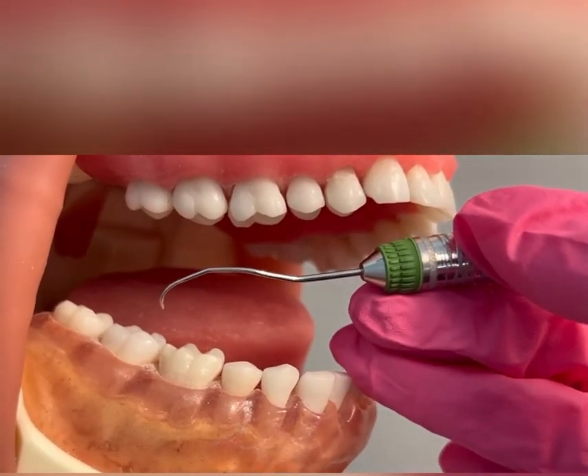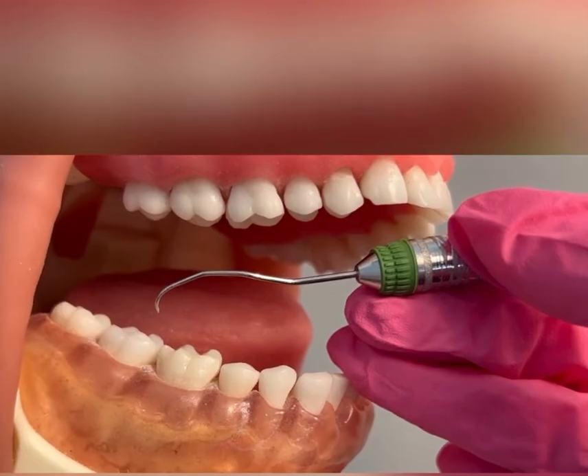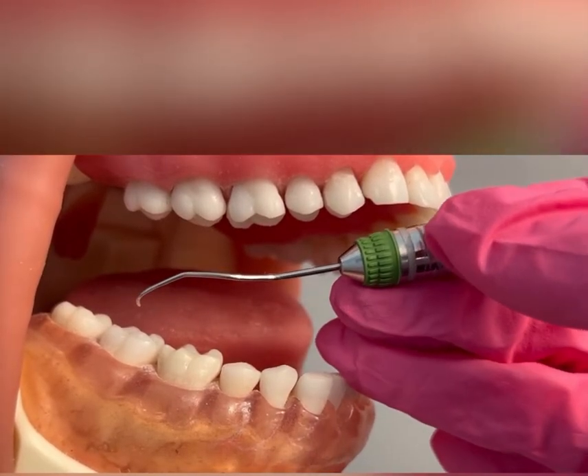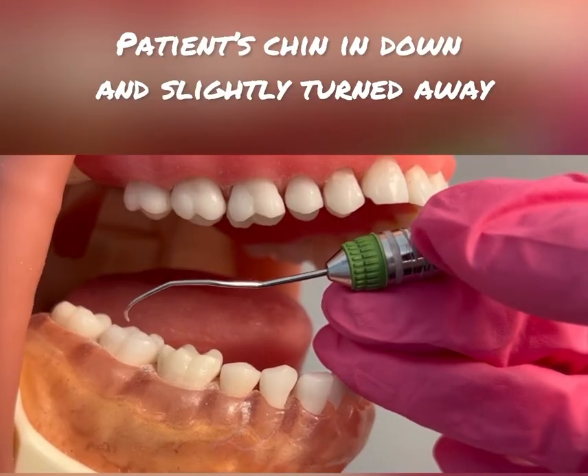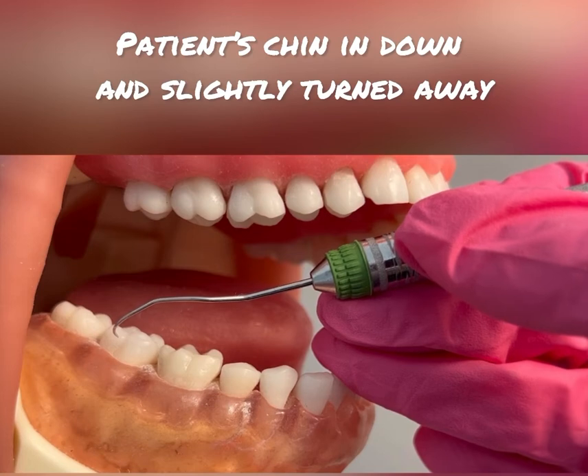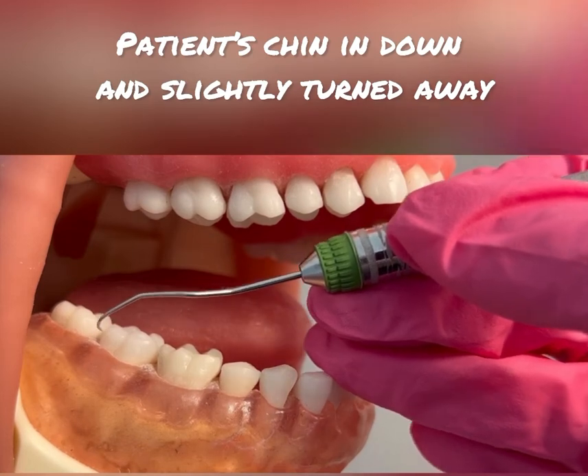For right-handed clinicians, you will be sitting at 8 to 9 o'clock. For left-handed clinicians, you will be sitting at 2 to 3 o'clock. I have the patient positioned with their head down because I am working on the mandibular arch, and the head is slightly turned away.